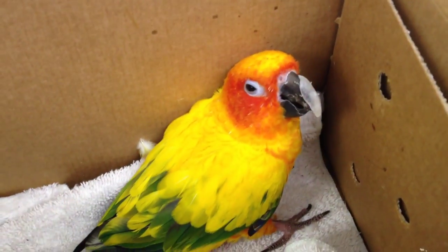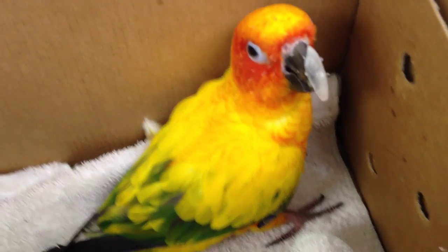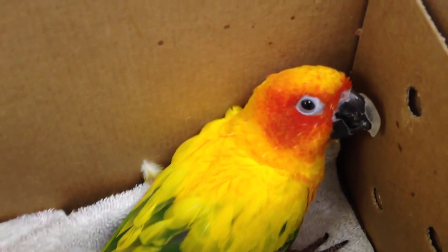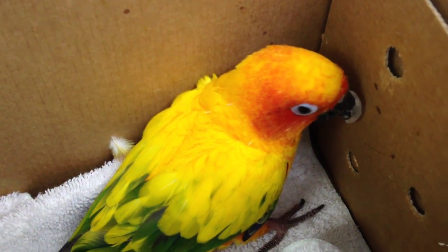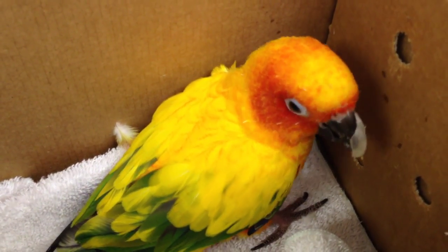Here's our little sun conure. There's another video just like this one where he had a different kind of beak on, and somehow after working on him his beak actually changed shape. So this time I put it in again a little bit differently — longer pins, or two pins as well.